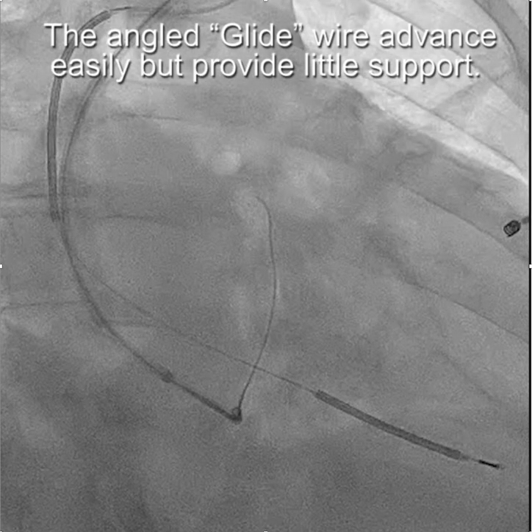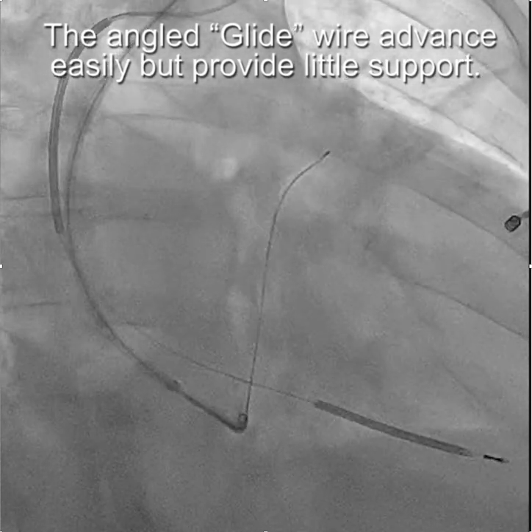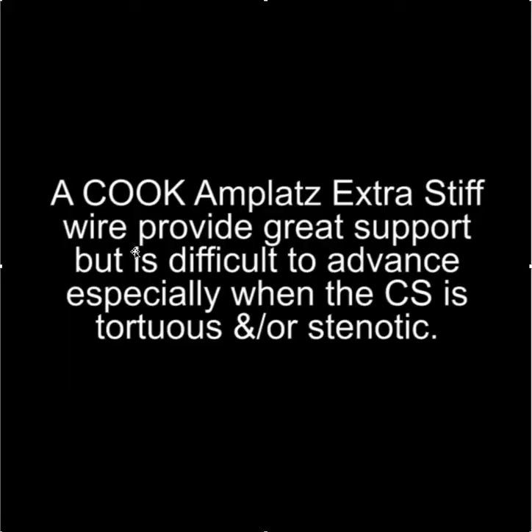So the goal using the Amplatz wire is to create a rail over which the sheath can be advanced. An angled glide wire advances easily but provides little support for advancing a sheath. The Cook Amplatz extra stiff wire provides great support, but it's difficult to advance, especially when the CS is tortuous or stenotic.